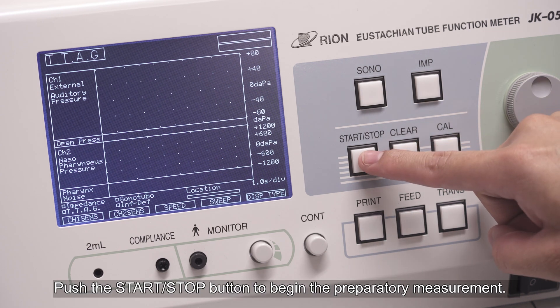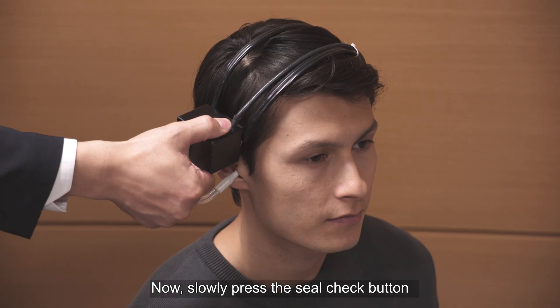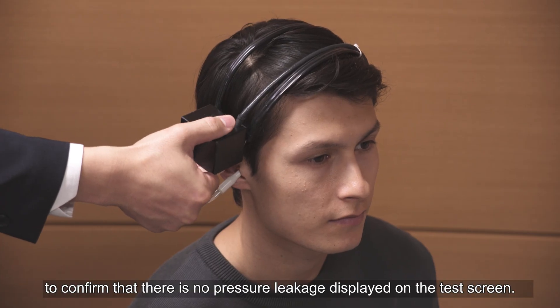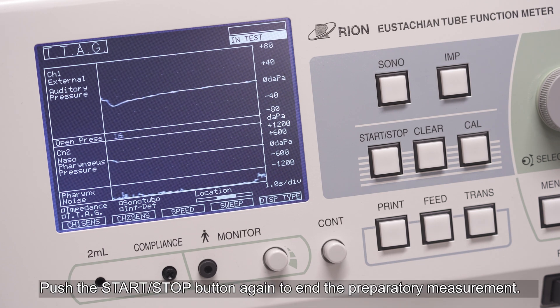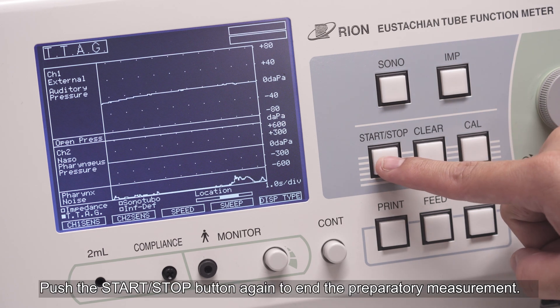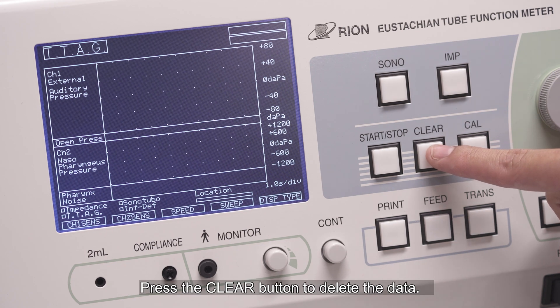Slowly press the depressurisation button on the TTAG headset to release any negative pressure inside the ear canal. Push the start/stop button to begin the preparatory measurement. Now slowly press the seal check button to confirm that there is no pressure leakage displayed on the test screen. Push the start/stop button again to end the preparatory measurement. Press the clear button to delete the data.